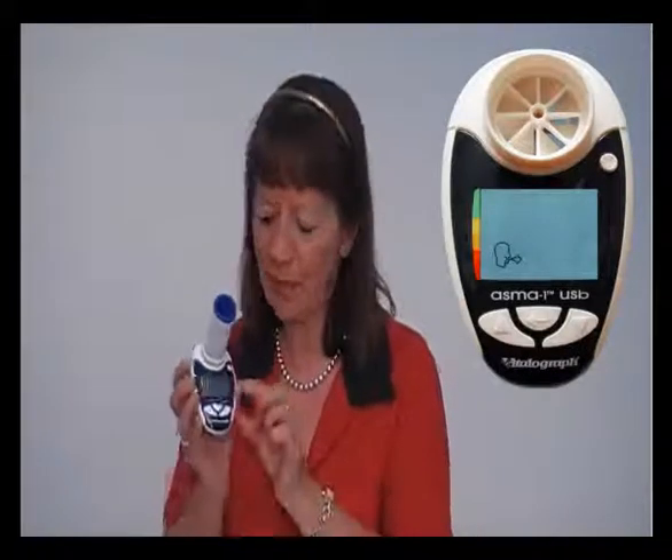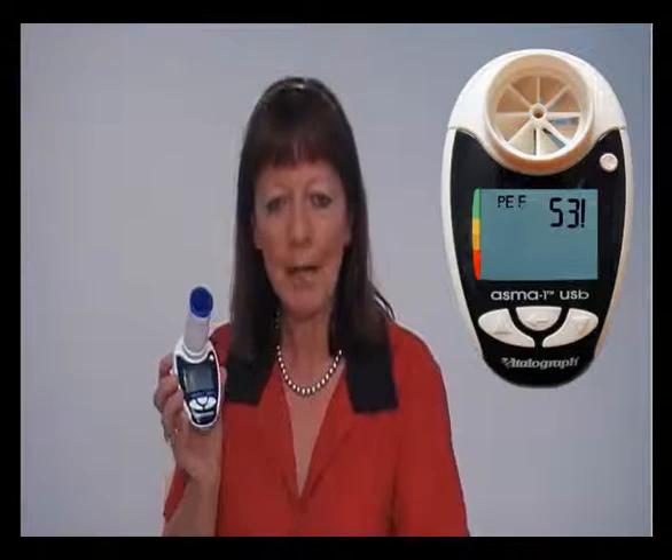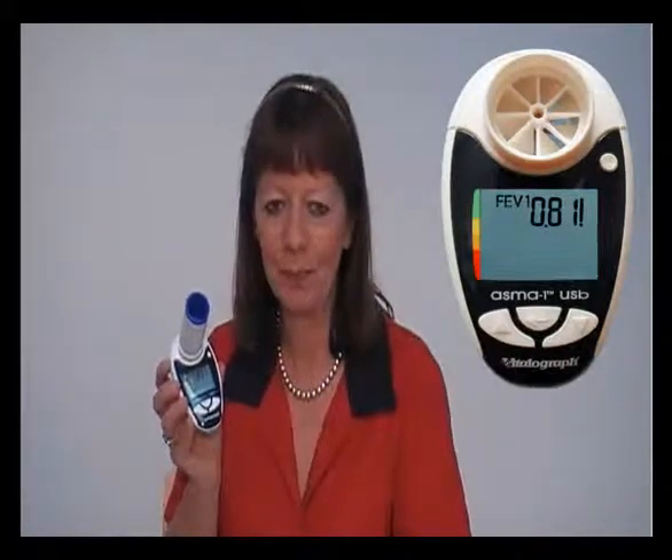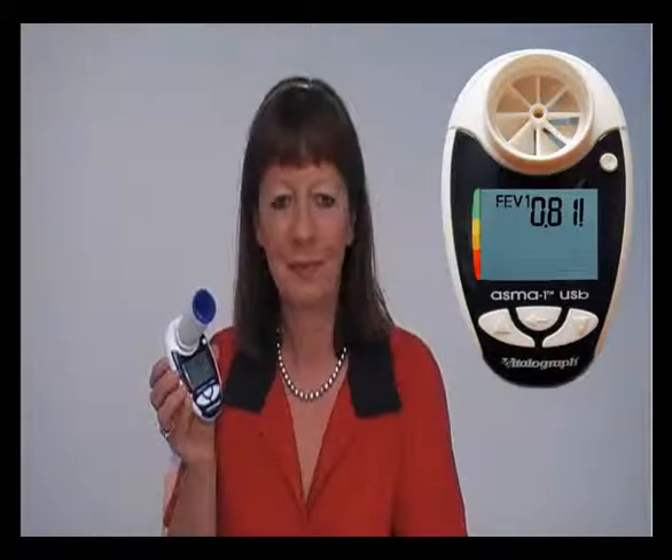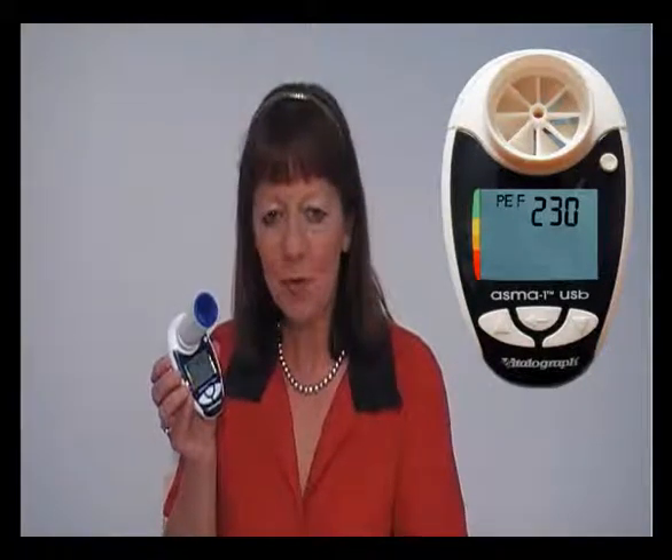A beep will sound to indicate that the device has measured the parameters. An exclamation mark appears on the screen if the blow had a poor start or a cough. Repeat this twice more so that you have performed three good tests. The peak flow and FEV1 measurements will be displayed alternately on the screen.